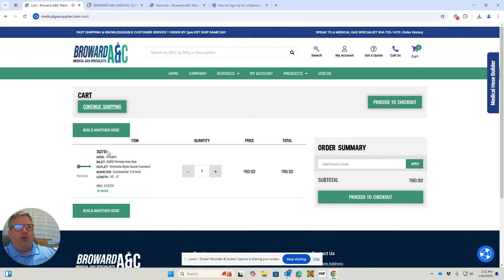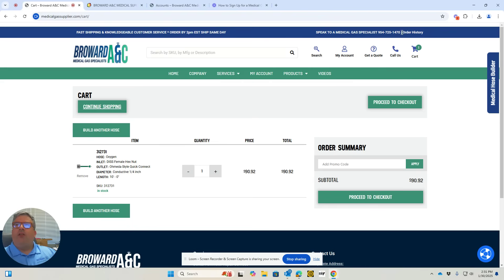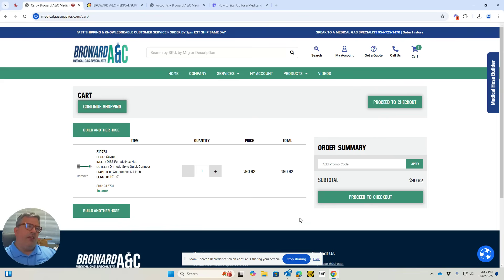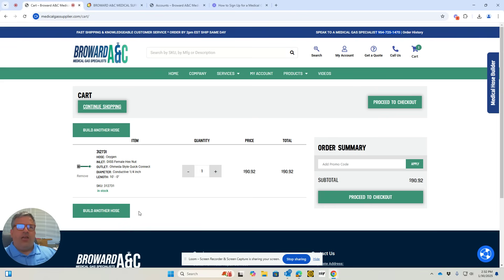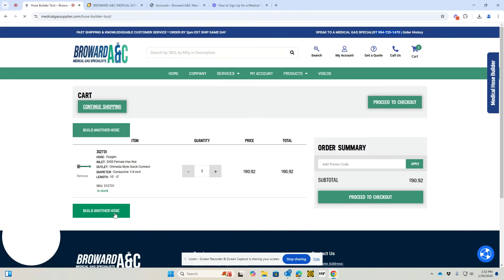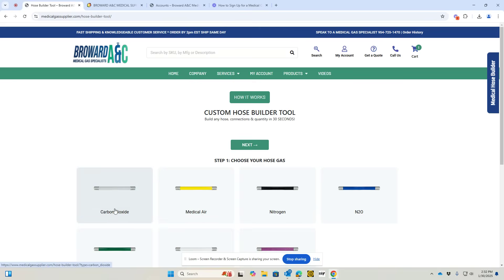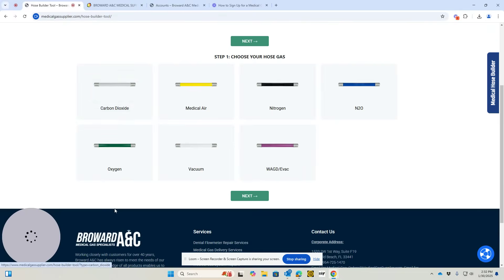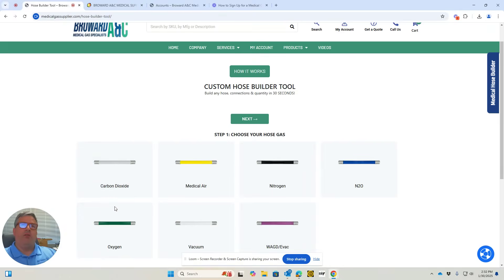You have your hose part number. If you have any questions, our phone number is at the top right. You can call, or proceed to checkout and order the hose. If you want to build another hose, you can build as many as you'd like. Just click on build another hose, and it will take you back to the beginning of the hose builder.